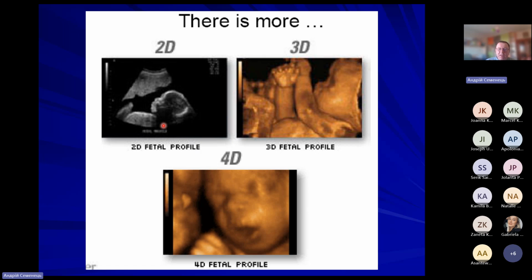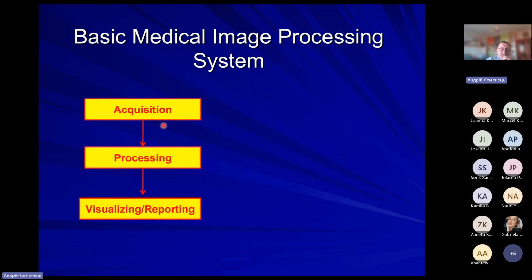They became capable of acquiring such a stream on the fly and transforming it on the fly, compared to CT scan, where first of all a relatively small amount of data is stored, because the number of pixels even in modern computer tomography is relatively low, even compared to a smartphone camera. So it took years, decades, before it became possible to do reconstruction for ultrasound images.